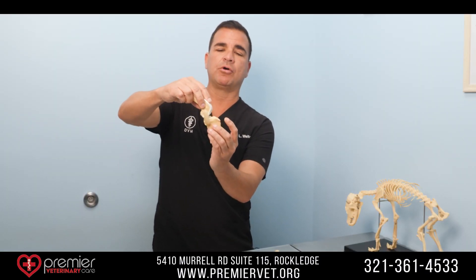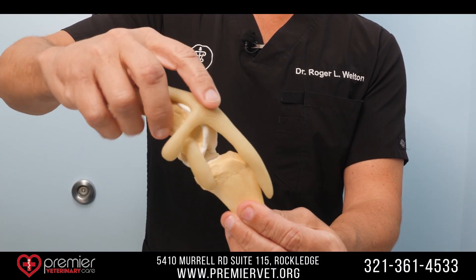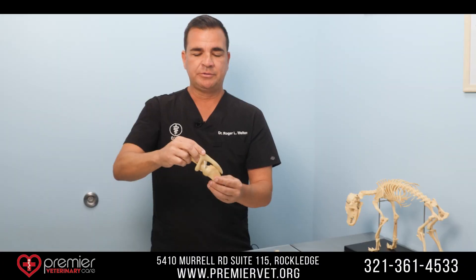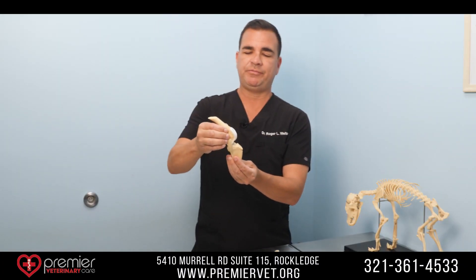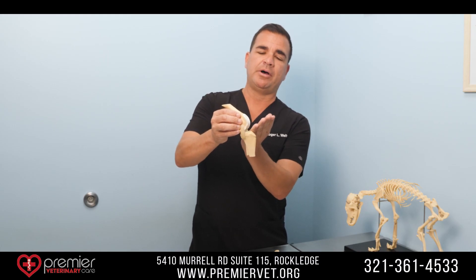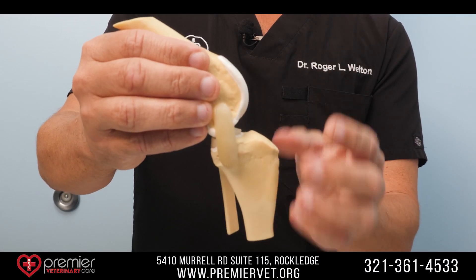When it ruptures it causes forward movement of the tibia, and actually when I go to diagnose it I can actually move the tibia forward, which is a hallmark sign we call cranial drawer. So when we think of the femur and how it articulates on the tibia, the tibia in the dog is at an angle of about 20 to 25 degrees.